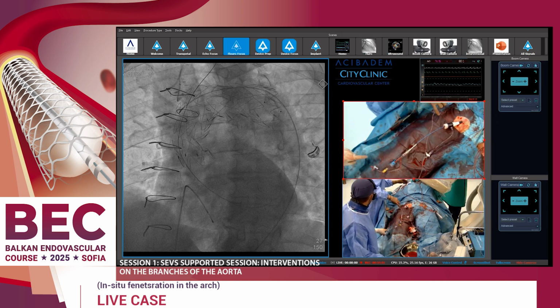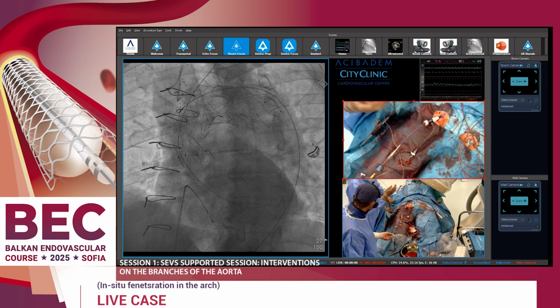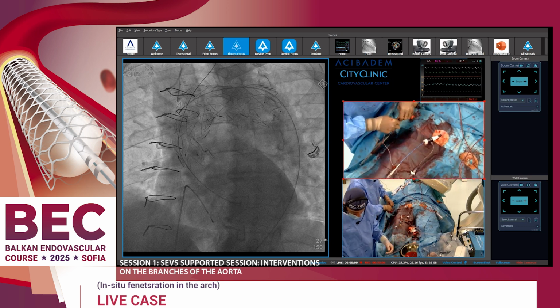So we are going to put a wire, whatever wire.